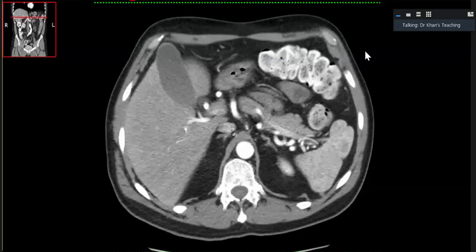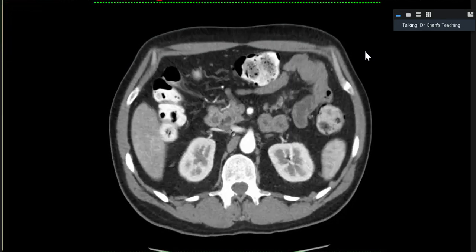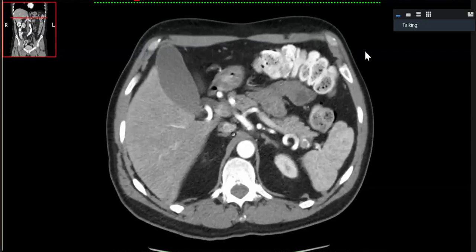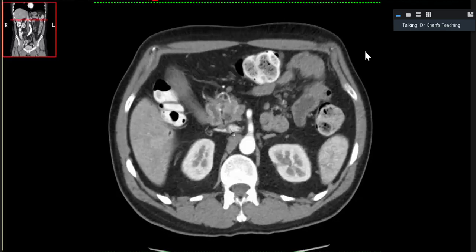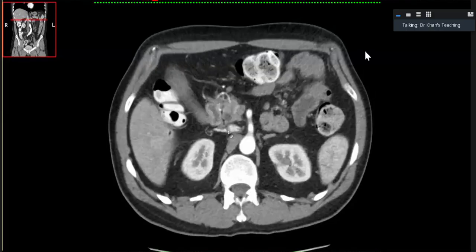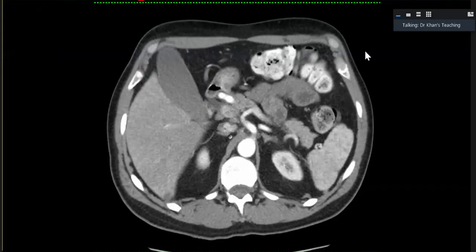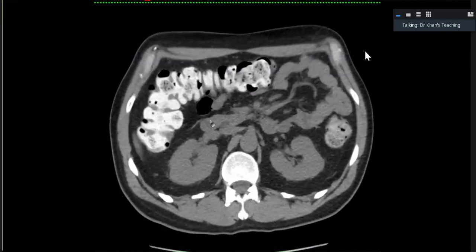Now, the key point here is that when you have raised the issue that there is active bleed, you must ask for a non-enhanced scan to confirm it. And if you don't ask that, that's something big. Why? Because with a non-enhanced scan, you have to confirm. And by the way, you did not ask for it.